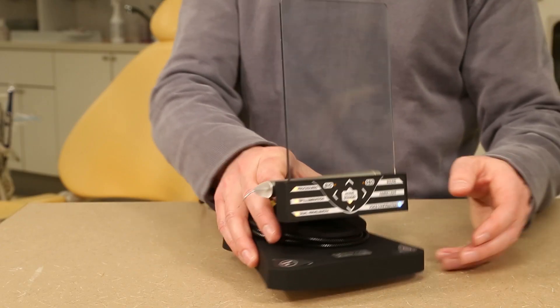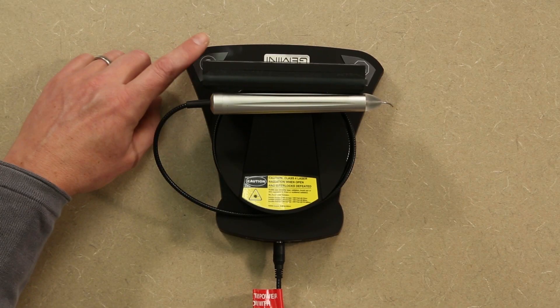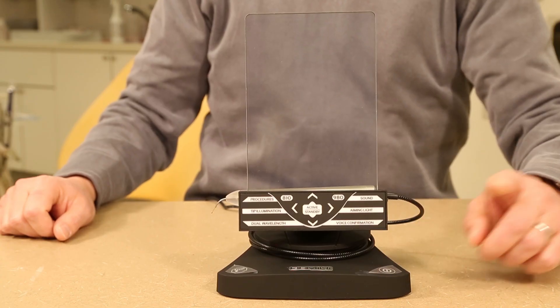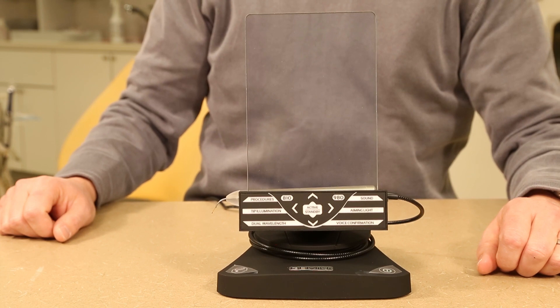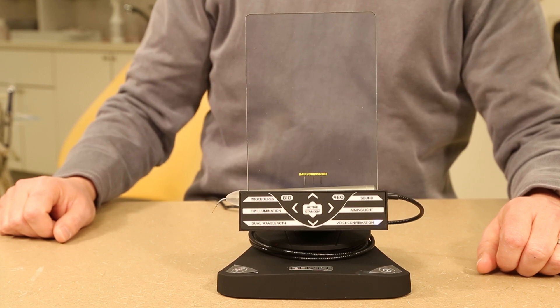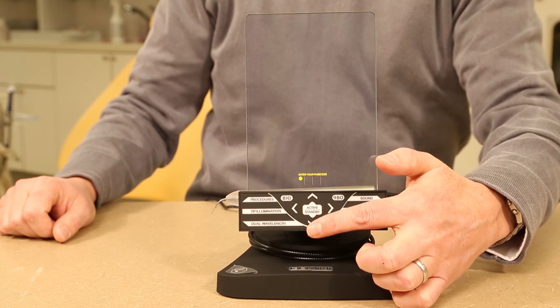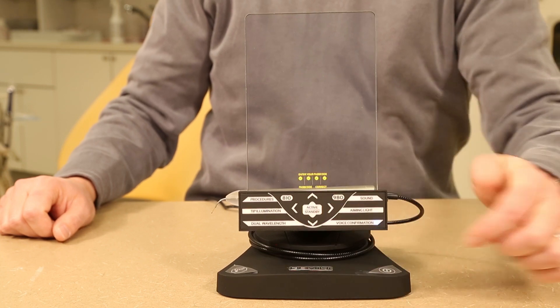Take care in handling the laser unit and only carry it by the base pedestal. Press the on/off button in the front right hand corner to turn on the laser. It will immediately ask for a passcode. That code is arrow up, arrow down, arrow up, arrow down.